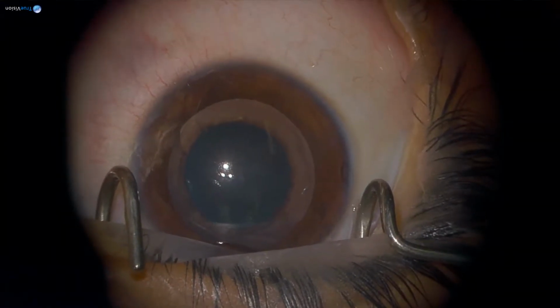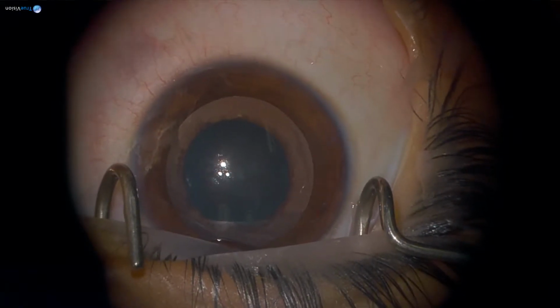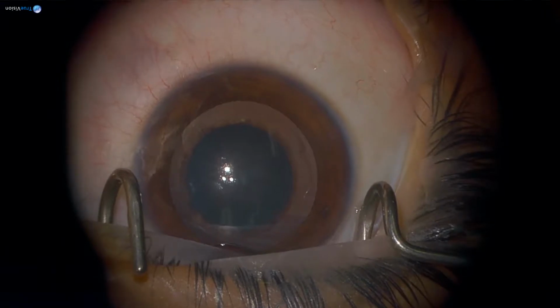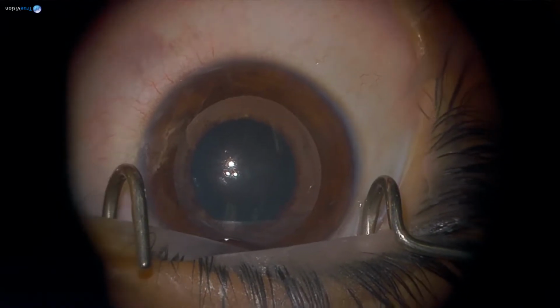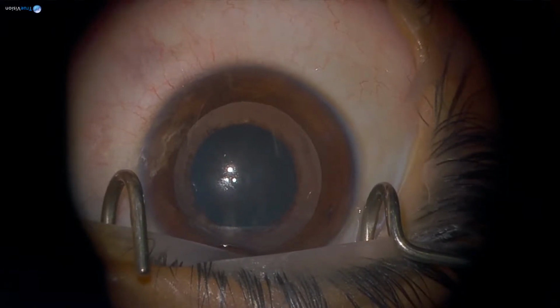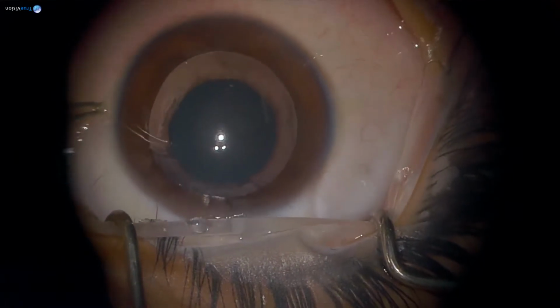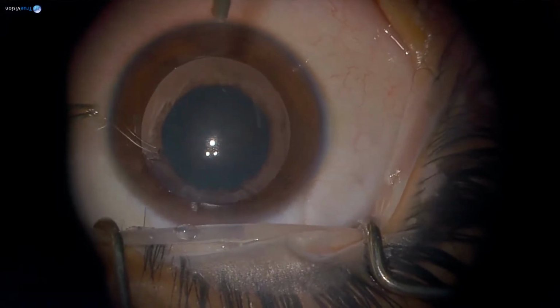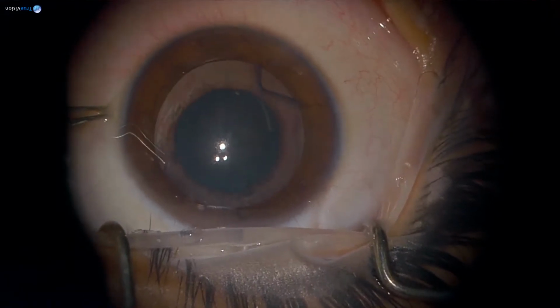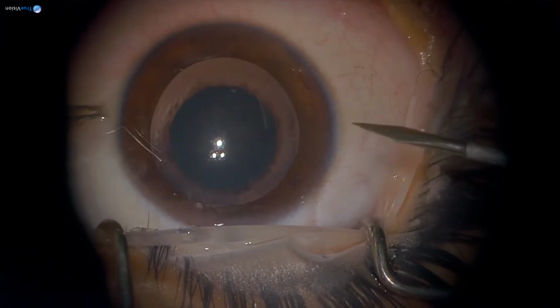This is a case of lamellar cataract in a 4-year-old girl, and she has a vision of hand movements close to face. She fixates very well. Her parents don't have any kind of opacity, and her B scan was normal, and we did the biometry as well. The keratometry was 41 and the axial length was 21.56. So we are going to implant a lens of 24.5 diopters.